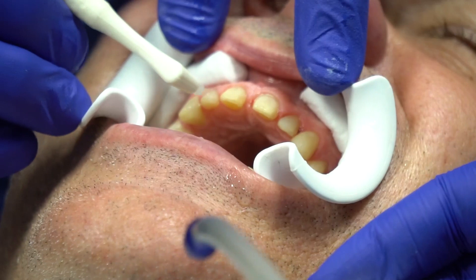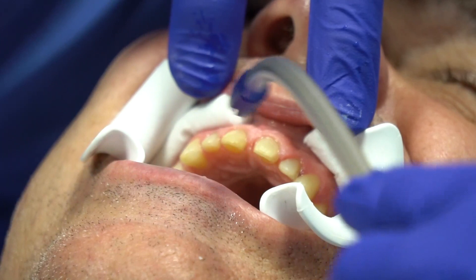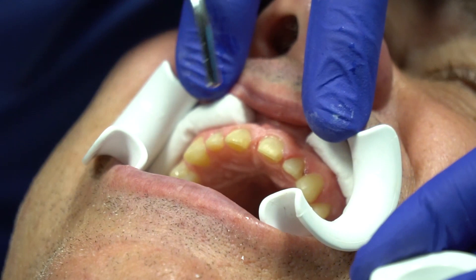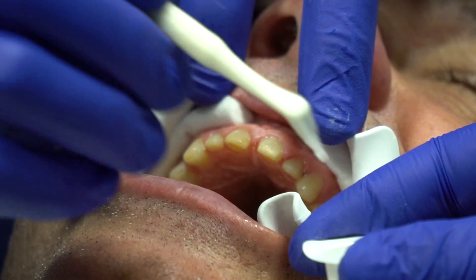The instructions say to do three or four coats, but if you apply multiple coats and evaporate with a saliva ejector rather than blowing hard, within one or two coats you can get a glossy surface. If you blow it really hard, the resin ends up somewhere else and not on the tooth. The thinner the bonding agent, the more you evaporate the solvent; the thicker the bonding agent, the more you can blow. I'll put two coats and let it sit and evaporate rather than blowing hard.